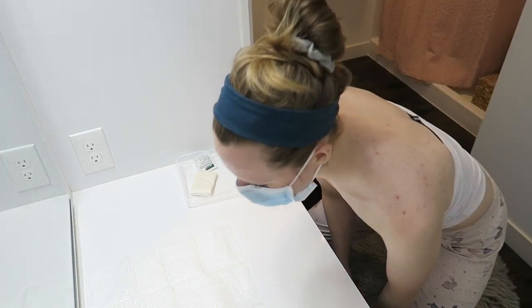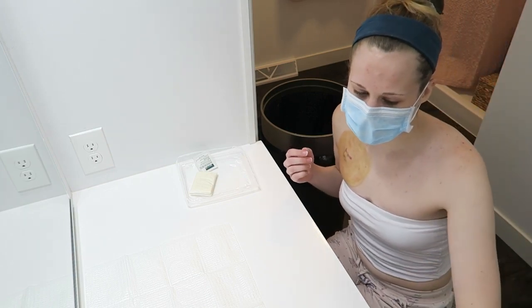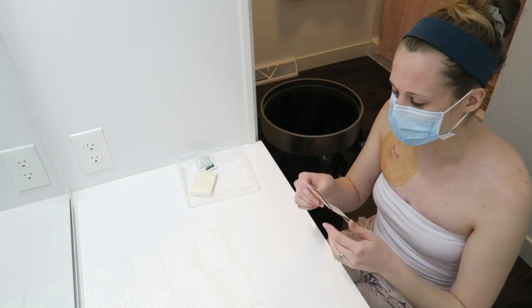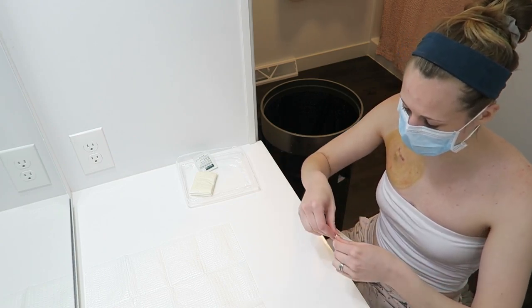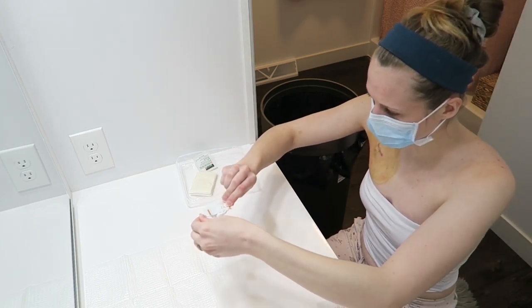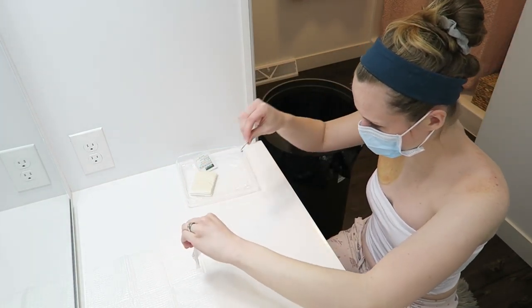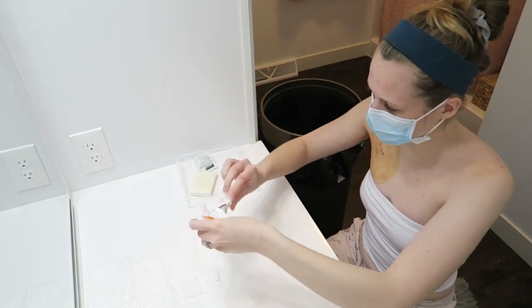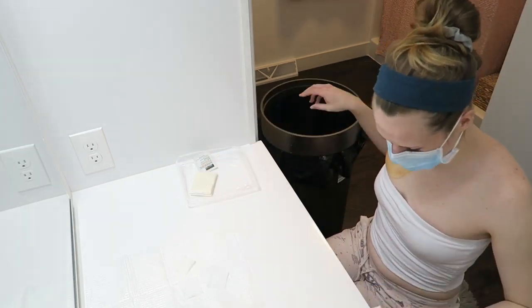There we go. The next step is a step that most people probably won't have to do, but like I mentioned, my infusion company does not supply me with alcohol swabs, so I have to use alcohol prep pads. These pads are sterile inside of the packaging. If you were to touch them with your bare skin, it would not be sterile. So what we are doing is we are going to open them and drop them onto the sterile field, which can be a little bit difficult. All right, I think that's about it.